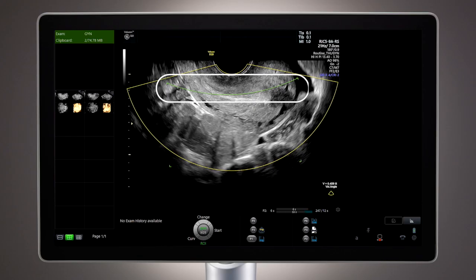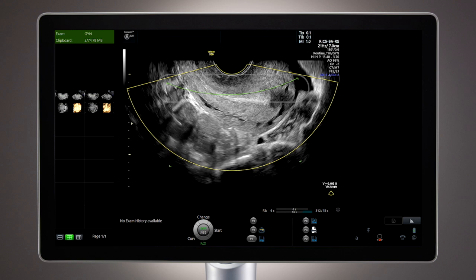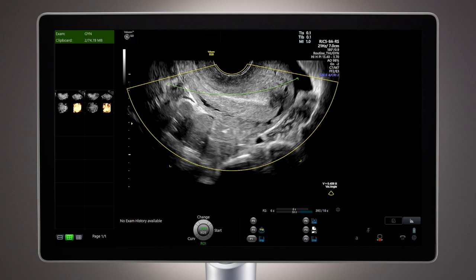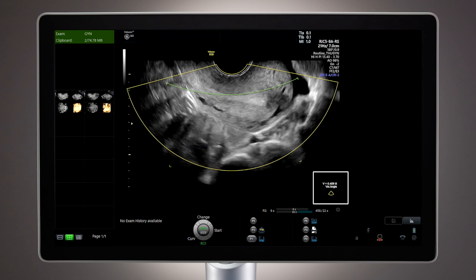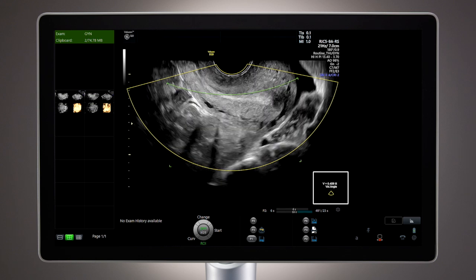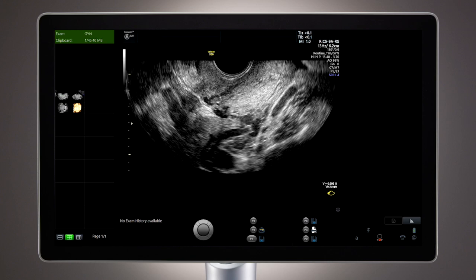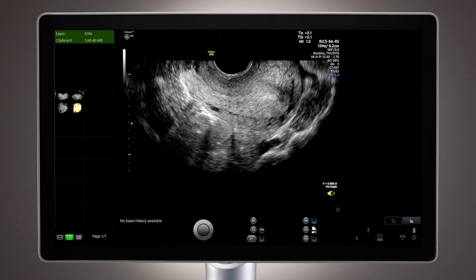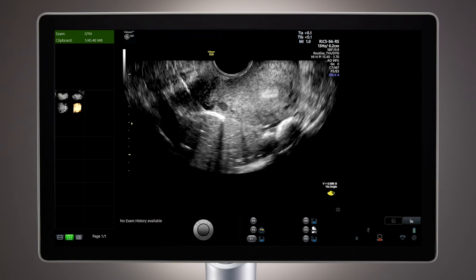The green line is the render line, the position from which the rendered volume is viewed. The area within this ROI is the anatomy that will be included within the volume. When acquiring a 3D volume, ensure that the width of the volume will encompass the anatomy to be included. This is controlled by the volume angle setting, which needs to be set appropriately to ensure the sweep begins lateral to the uterus and ends after the transducer has traversed the entire sagittal uterus.